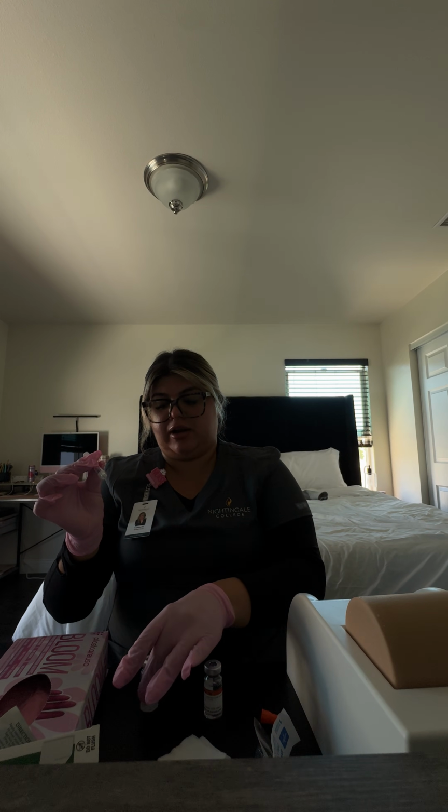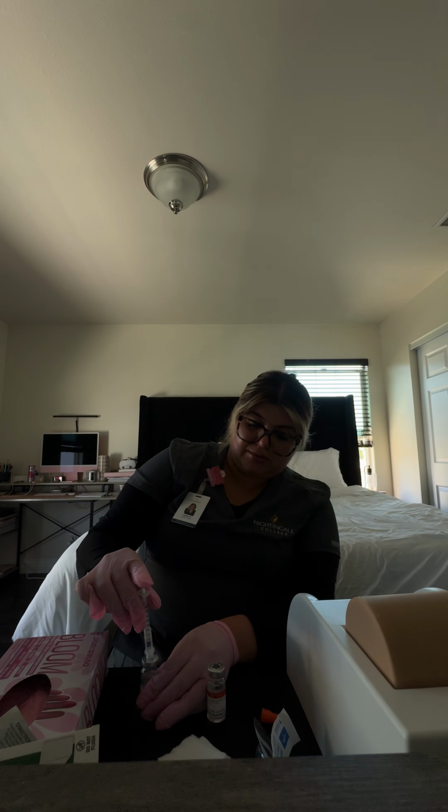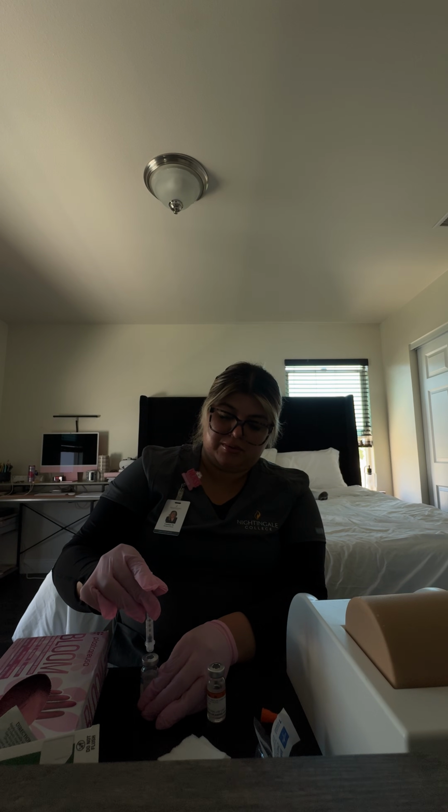We're going to grab our NPH, or intermediate insulin. We're going to carefully inject it without touching the solution. We're going to inject the air. We're going to withdraw the needle, and then we're going to draw up 4 units of air. Okay, and then we're going to inject that into the vial of the regular insulin.